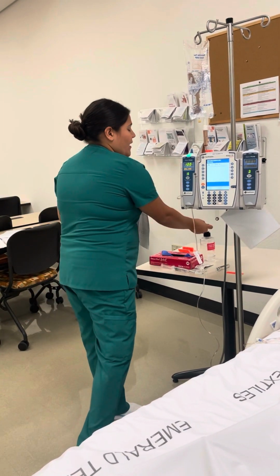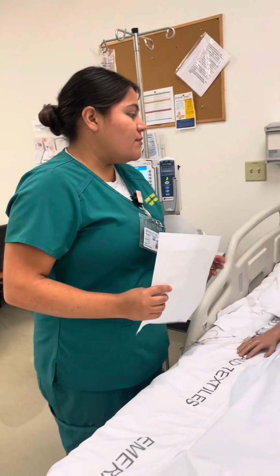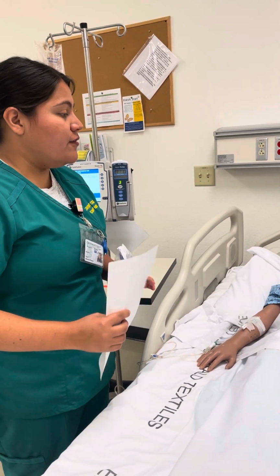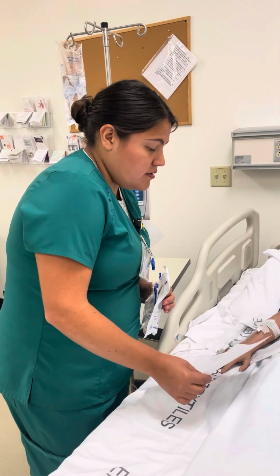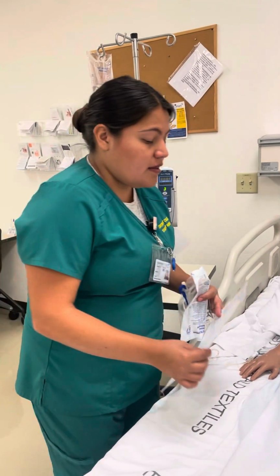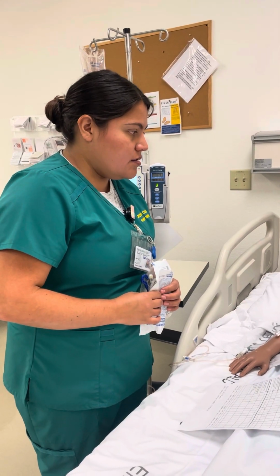I will perform hand hygiene before entering into the room, and I will introduce myself. Hello, my name is Paola, and I will be your nurse. Could you please confirm your name and date of birth? Okay, and checking with the bracelet. Could you tell me if you have any allergies to any medication?